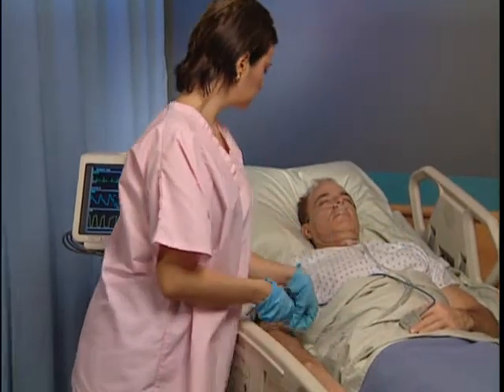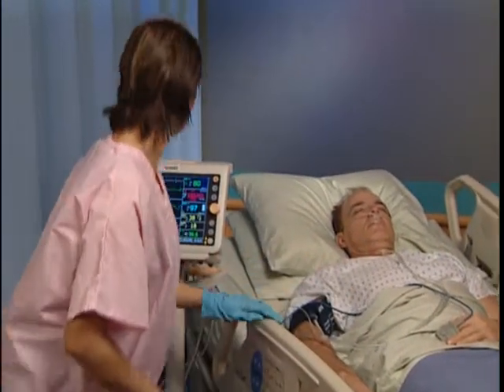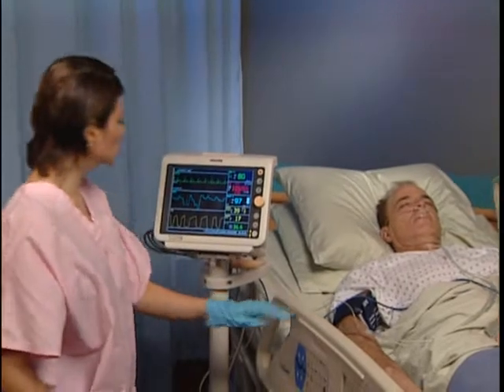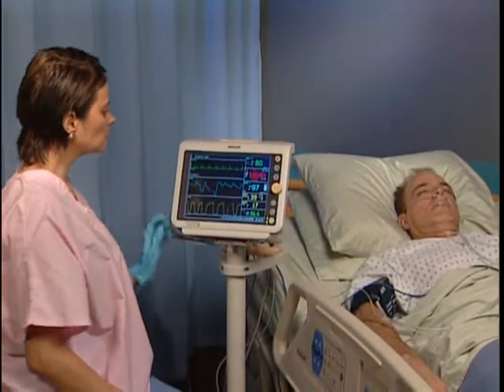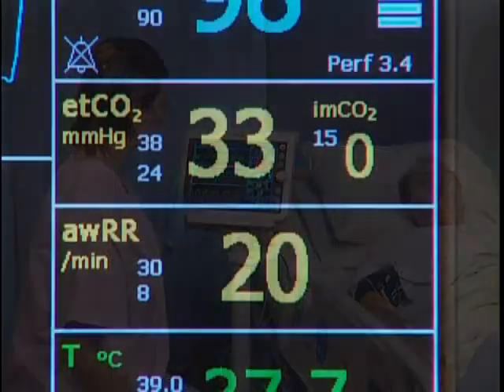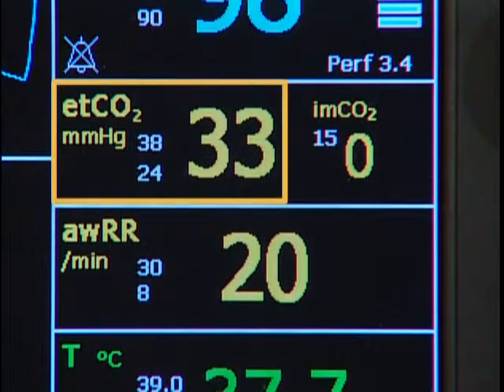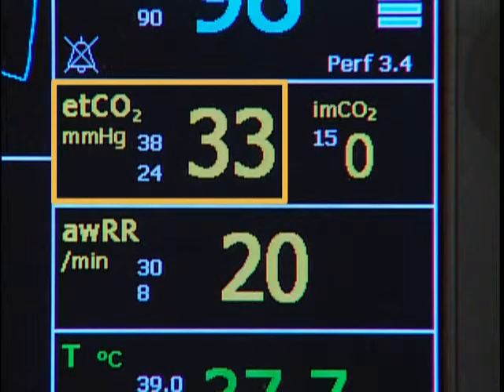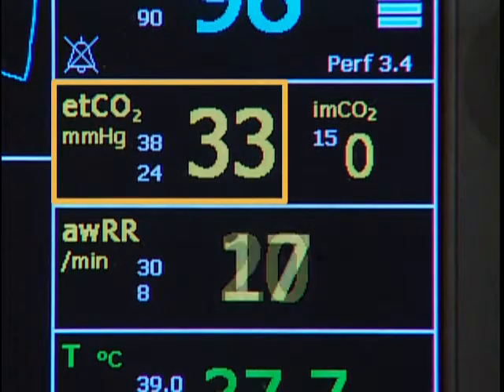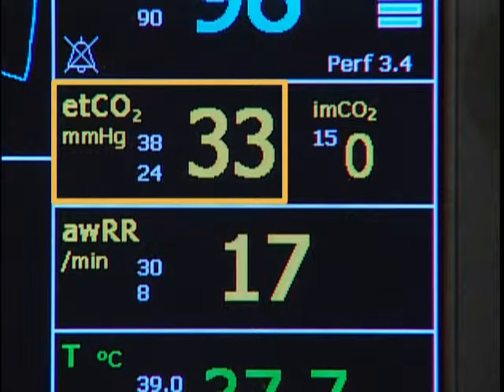There are three numerics associated with CO2 monitoring. The first is ETCO2, or end-tidal carbon dioxide, which is the peak CO2 value measured at the end of each expiration.